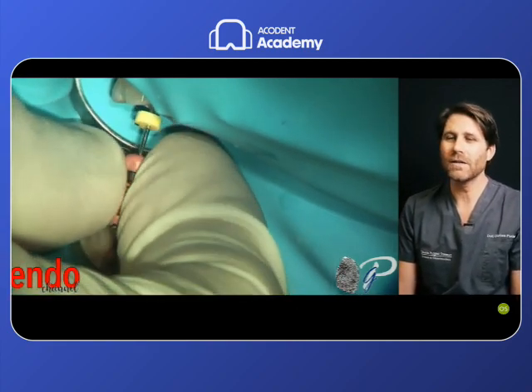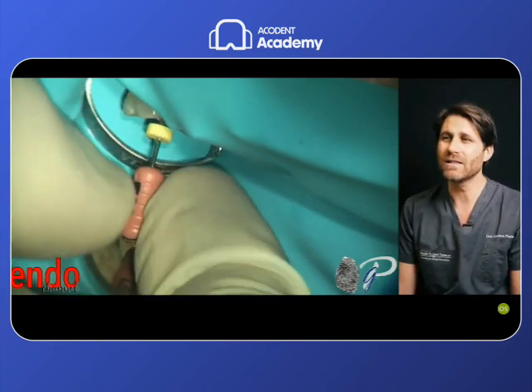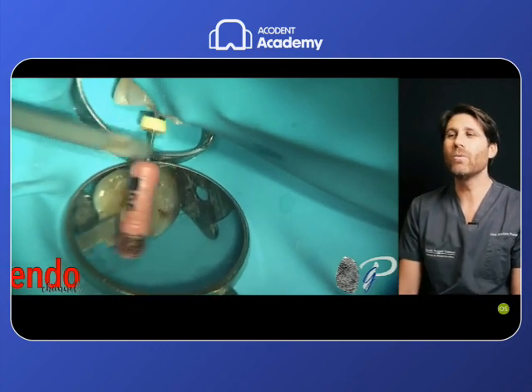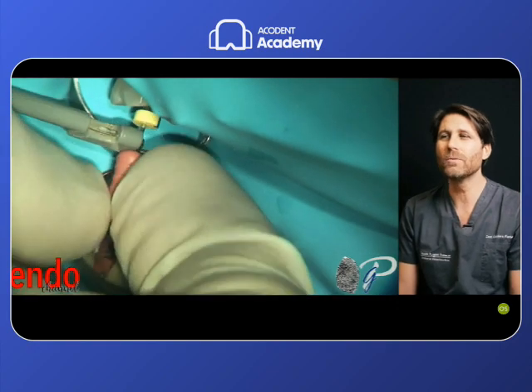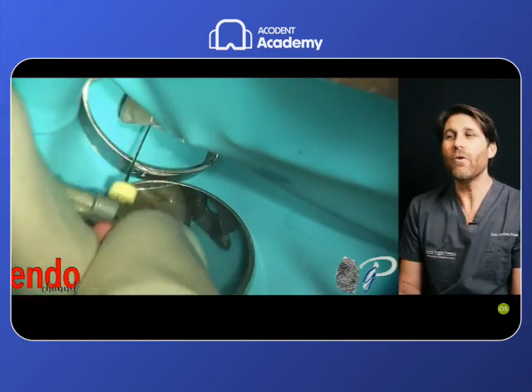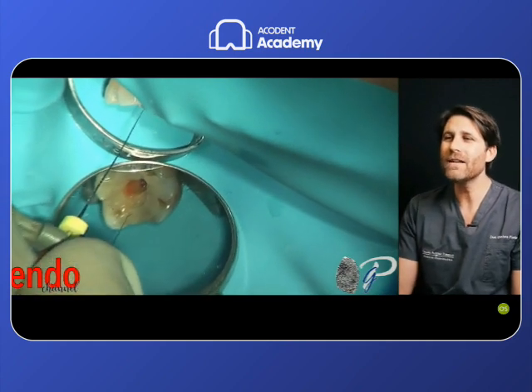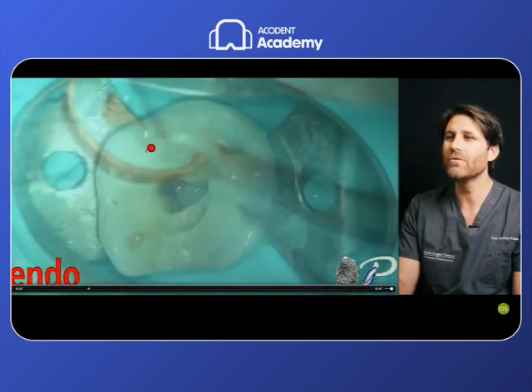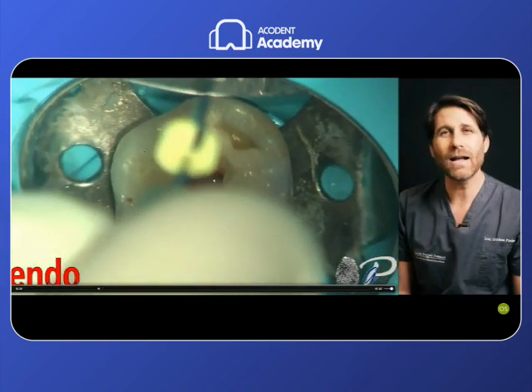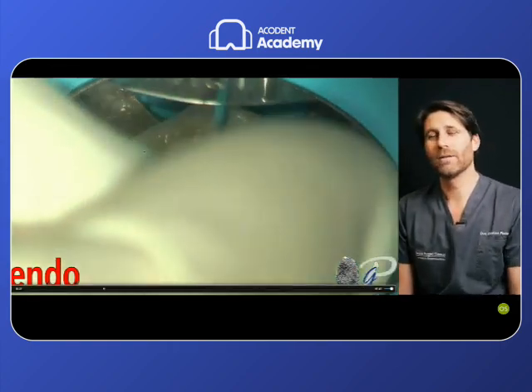In the molars, I start with the 8 or with the 6 stainless steel file with this watch winding movement, without working on the file, without trying to bypass any difficulties. If this file follows the natural path, even in presence of a small apical curvature like this, as we have seen on the file, it means that there is a natural scoutable path to our stainless steel file.